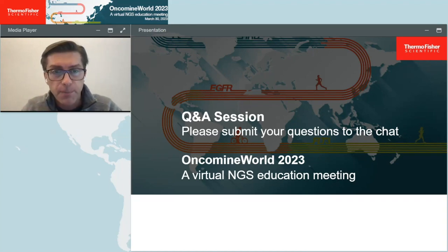All right, next question. What is the cost to sequence a whole human genome on the Genexus? So we generally don't sequence whole human genomes on the Genexus. That's just not what it was built for.